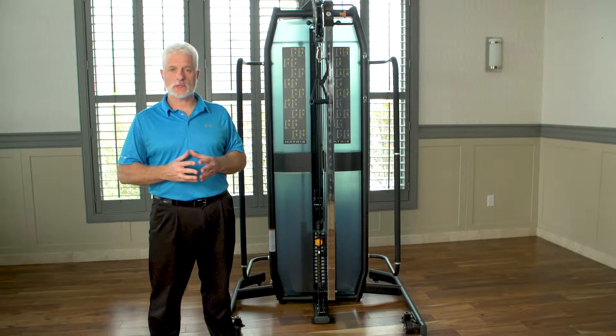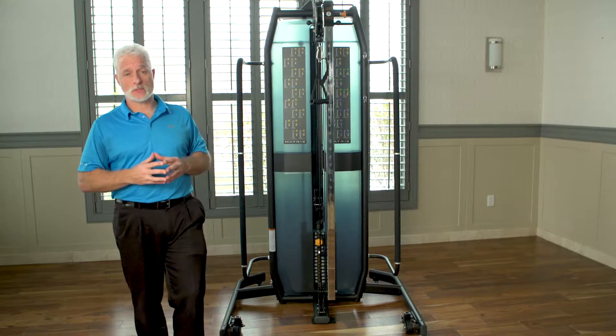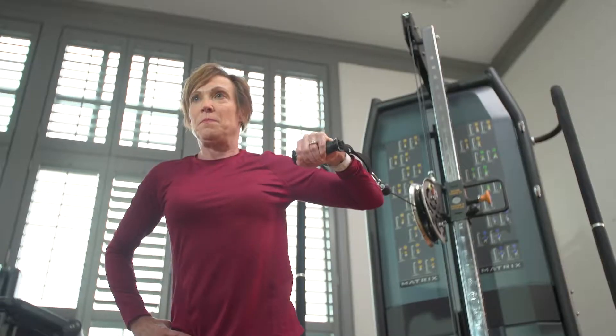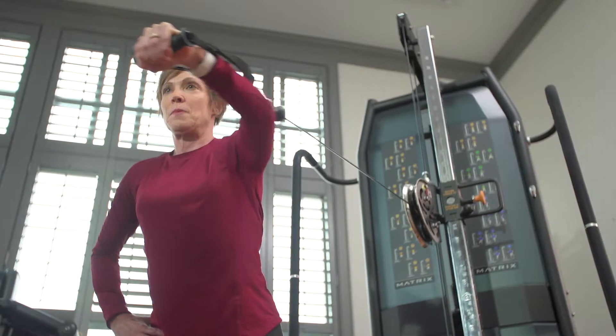Hi, I'm Dr. Scott Benjamin. Today we're going to talk about Upper Extremity Strengthening. This adjustable pulley system by Matrix is very versatile for what you need in your physical therapy clinic. As physical therapists, we always want an eclectic array and variety of exercises for our Upper Extremity patients.